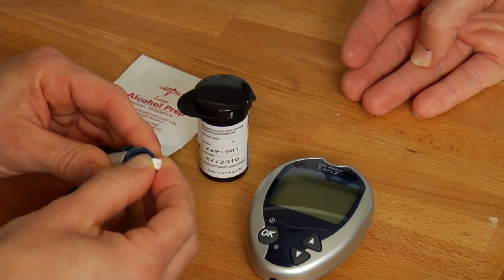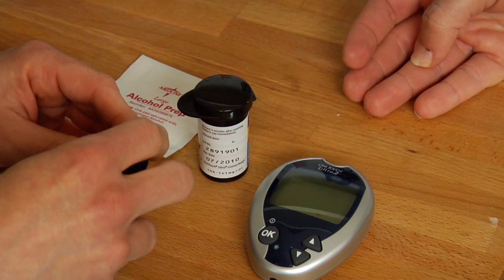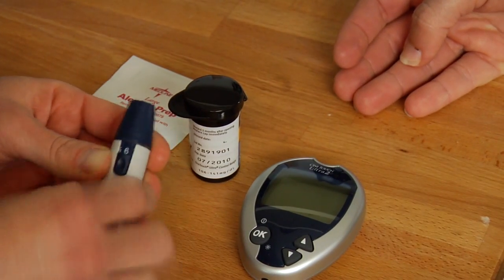You're going to take the lancet, which has the needle in it, insert it into the plunger, and you're going to adjust the height of what you prefer — the height that the needle is going to hit your skin, piercing the skin and drawing the blood.